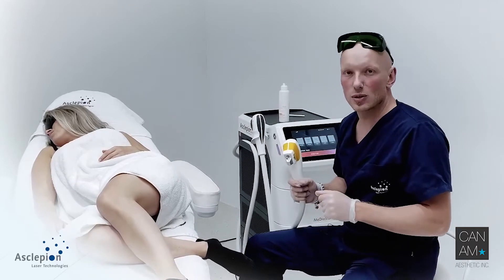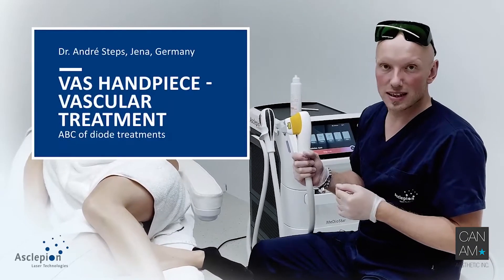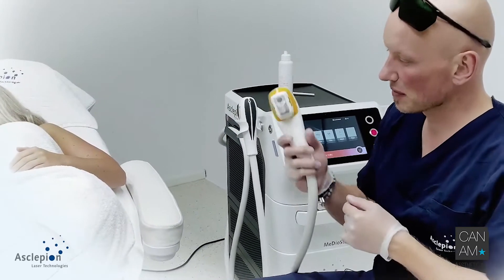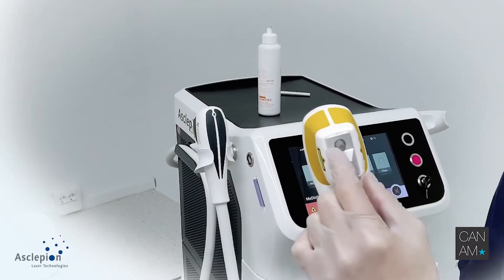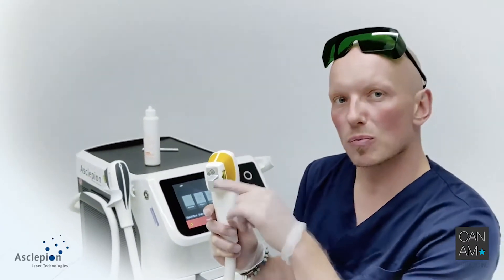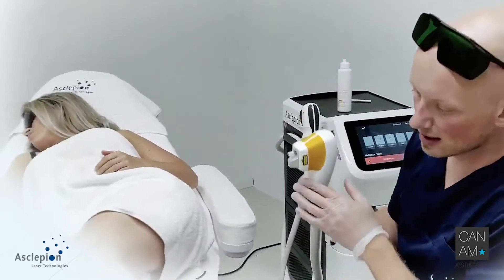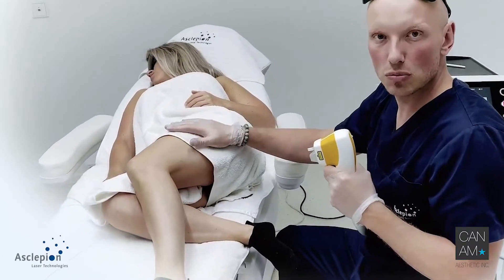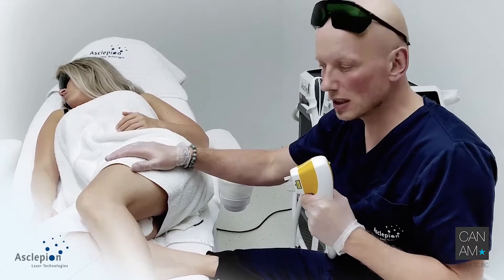Besides hair removal, skin whitening, and skin tightening, there is another handpiece and another application: the vascular handpiece. This is how it looks. You have the cooling tip and the laser tip. It's a round-shaped spot, but there is an active rectangle of 3x4 mm. It's pretty good for telangiectasias, angiomas, hemangiomas, port wine stains, and leg veins. And this is what we are doing here now.